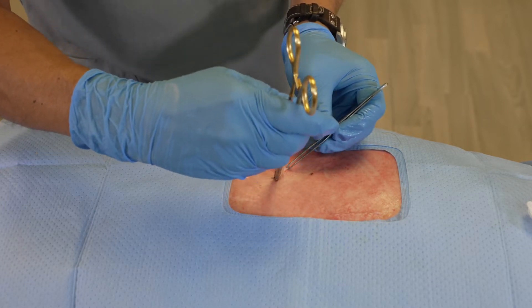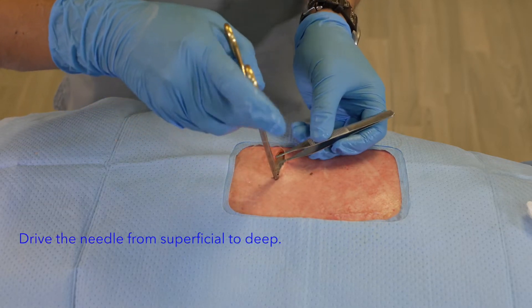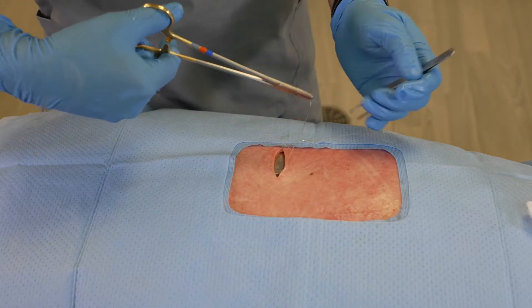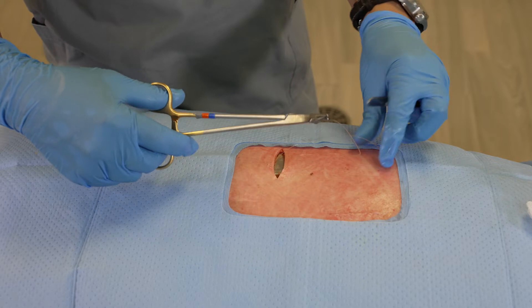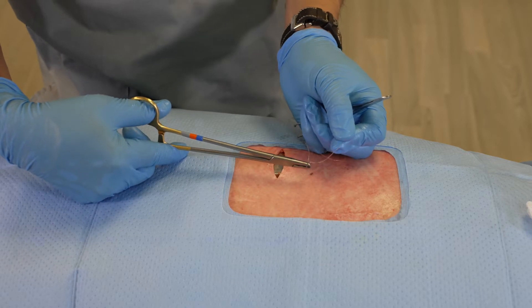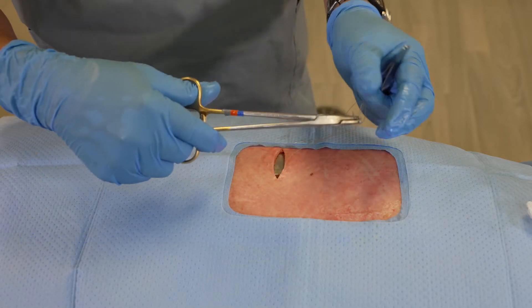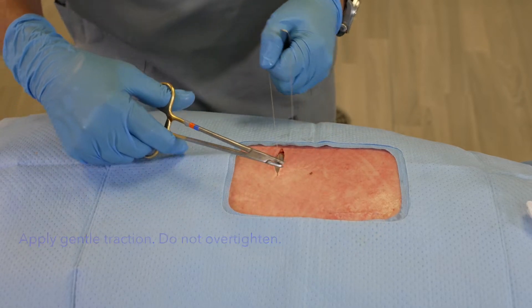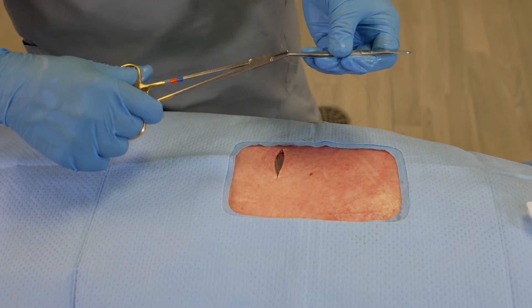Now I'm coming to the other side and again approximating just about the same area as where I inserted the original suture. In doing so, we're now going to take the loop at the end of the suture and pass our needle through this loop. What that does is lock this down in place such that we get a nice, tight closure.